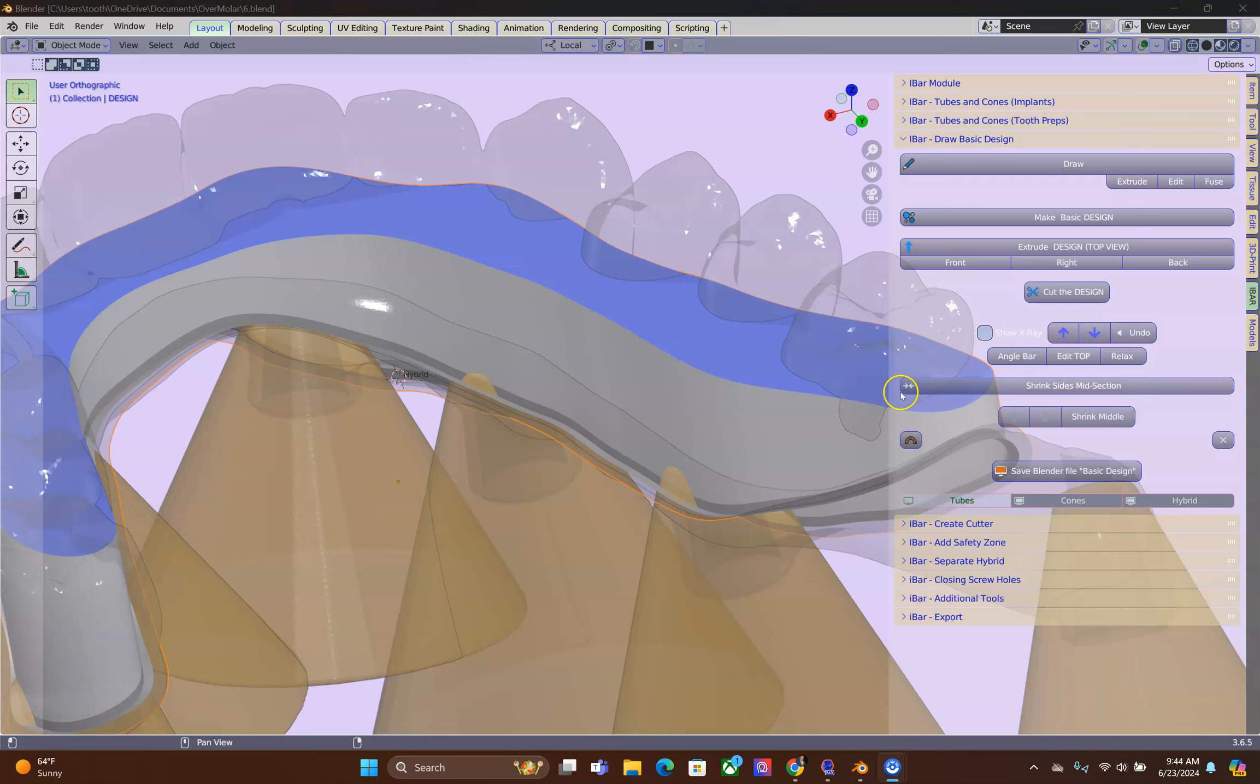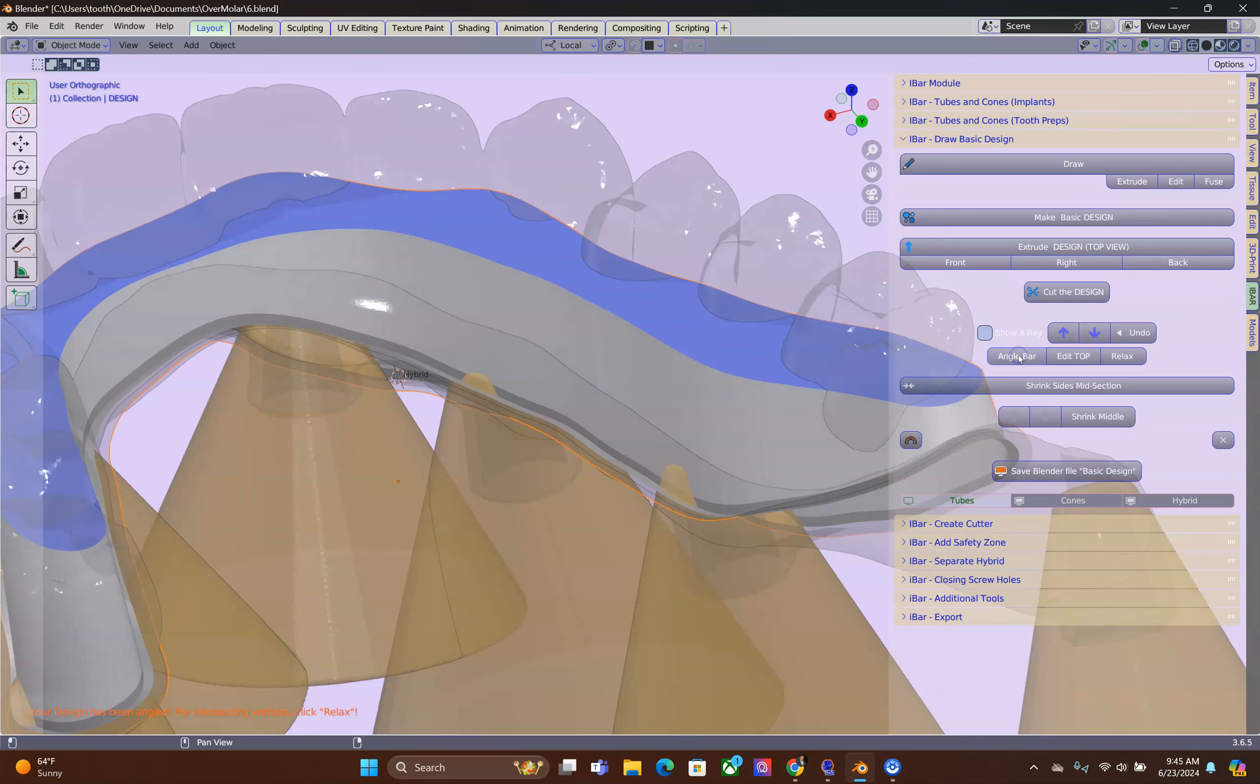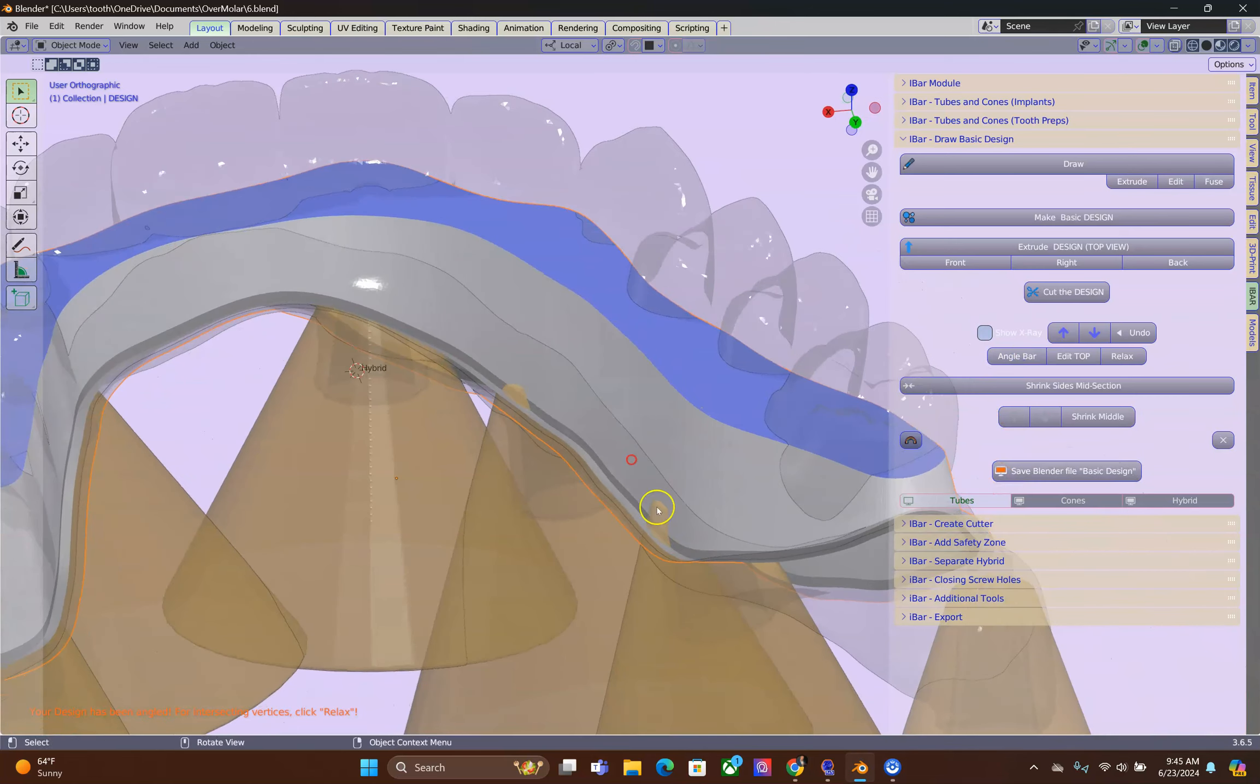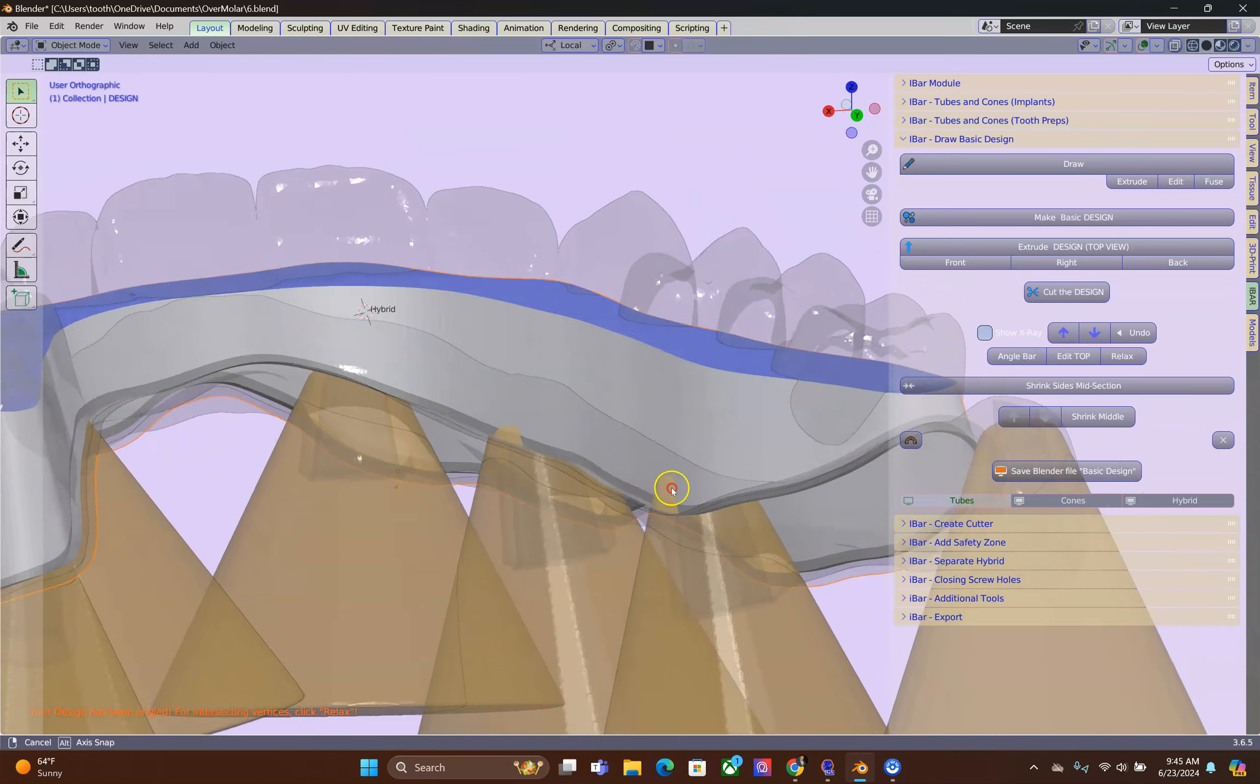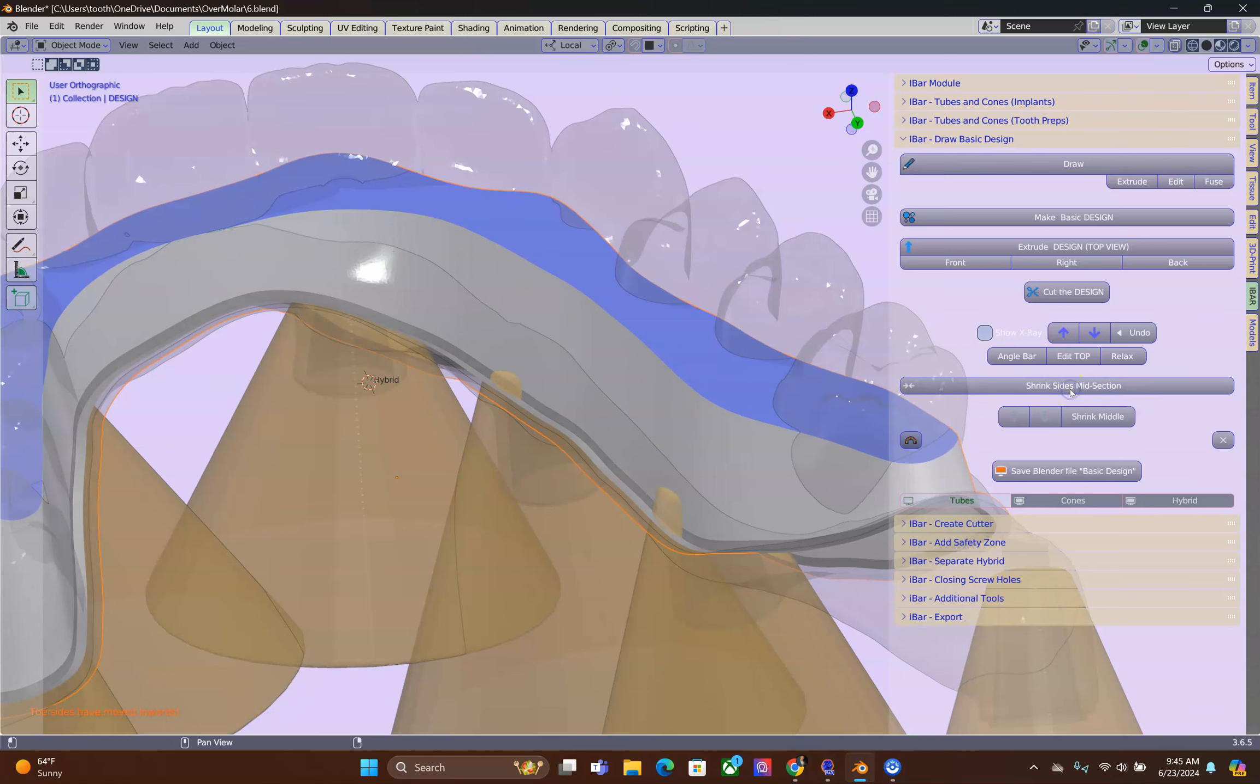We're going to lower the blue surface. But before I do that, I'm going to angle the basic design a little bit. I'm also going to make it a little bit narrower.